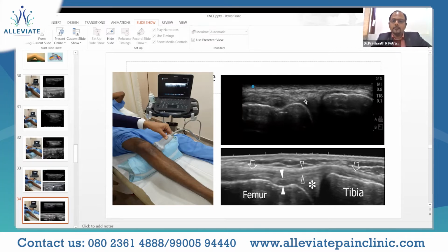In the joint space we are able to appreciate a triangular hypoechoic to hyperechoic structure, which is nothing but the medial portion of the medial meniscus, marked by an asterisk over here. And then the tibial bones. We also appreciate a small hypoechoic area over here that could be the meniscofemoral ligament, and then the portion of the joint capsule on the surface. Mind you, we are not that medial where you can visualize the MCL as such right now.